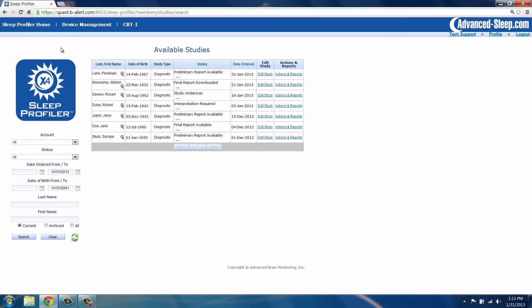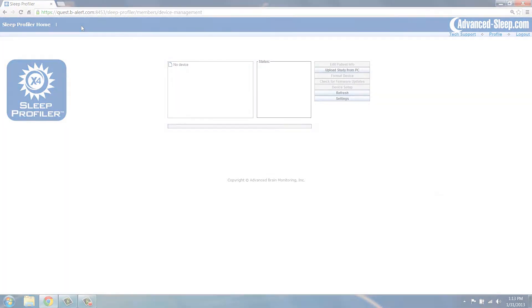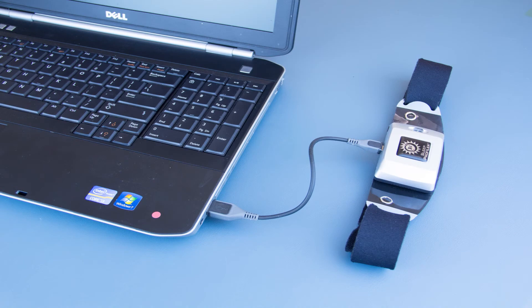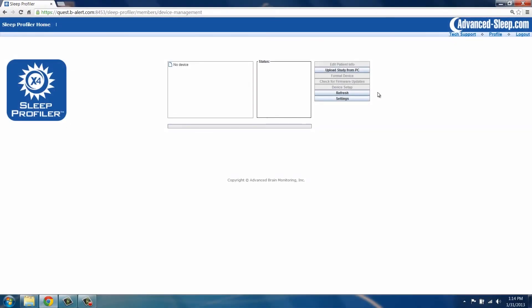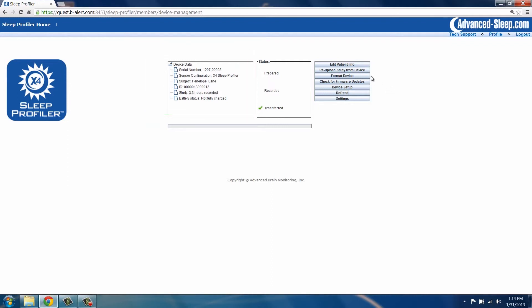To do this, on the Sleep Profiler home page, select the device management button. Connect the device to your computer using the micro USB cable. Click the Refresh button. The device serial number will appear under Device Data. Select Format Device.